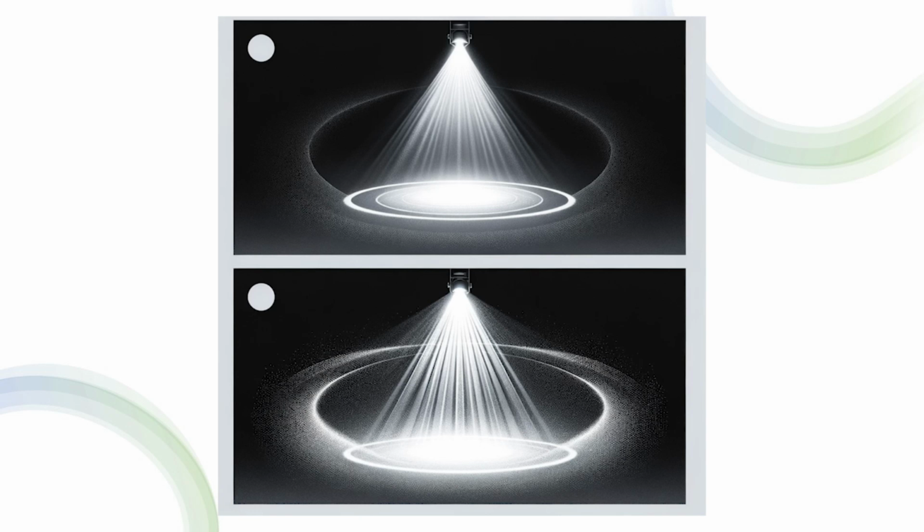To reduce light bleeding, one approach is to adjust the exposure time. By setting the appropriate exposure time, it's possible to minimize the unnecessary curing of resin. Additionally, using a more precise light source can also help in reducing light bleeding.